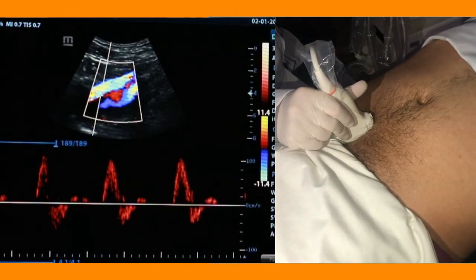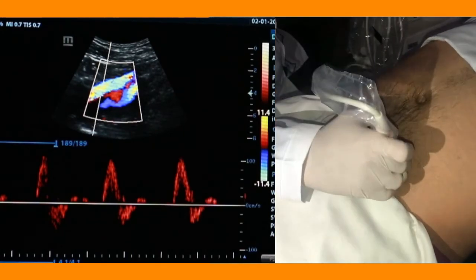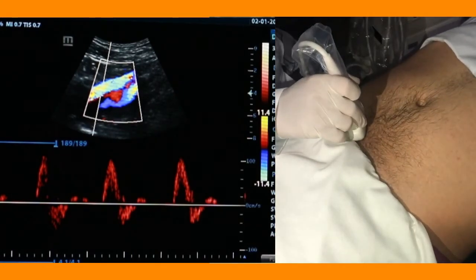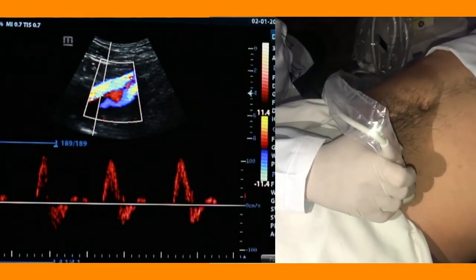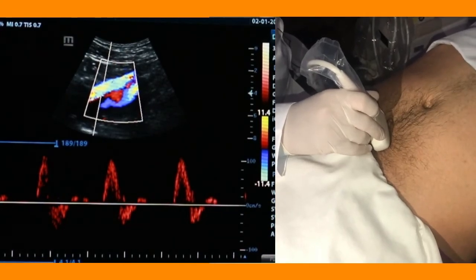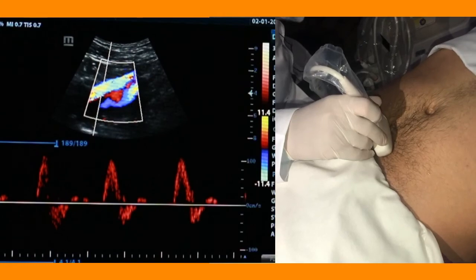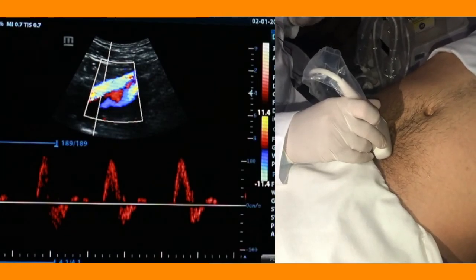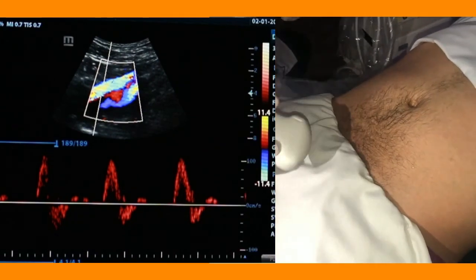Until this point, I'm sure that there is no aortic aneurysm or any aneurysm in the iliac vessels, and I'm sure that the triphasic flow is here, triphasic flow is here, triphasic flow is here. All of these exclude aneurysm, and exclude any significant stenosis or occlusion in the arterial tree. Then we will jump to the femoral regions on both sides. Thank you.